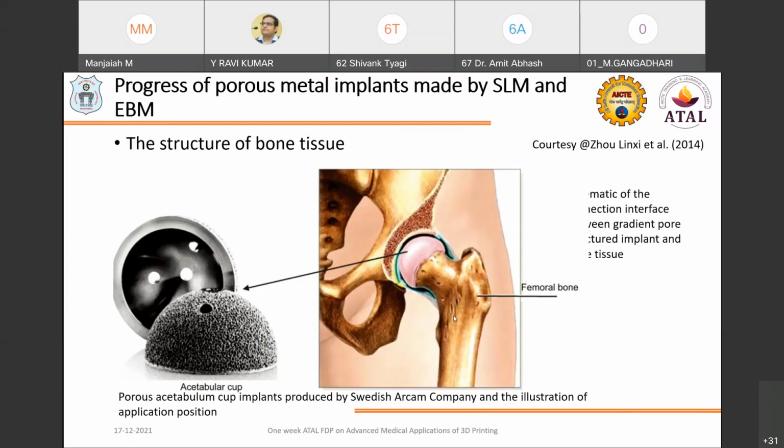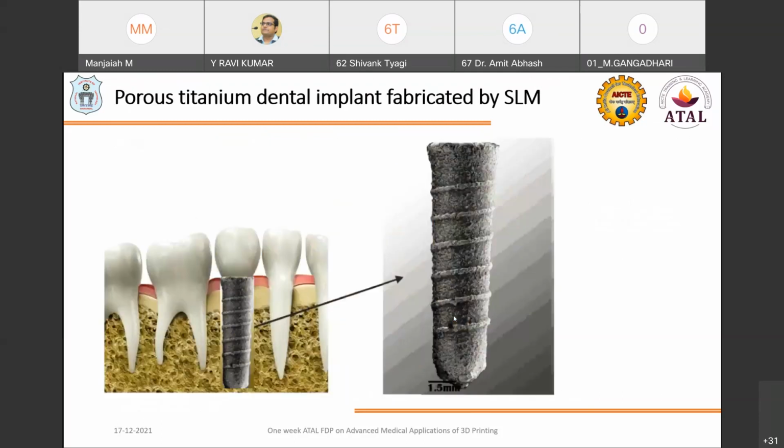When it is a cranial plate implant, porosity is especially important in providing bone cell ingrowth as well as fastening to the skull. That is the major requirement of these porous structures. And also the acrylate biomodel using liquid resins, as well as rapid prototyping, can be made with this kind of additive manufacturing process.